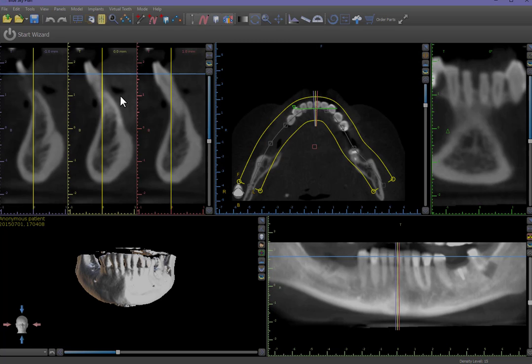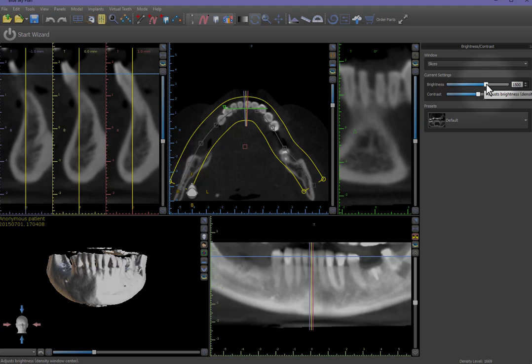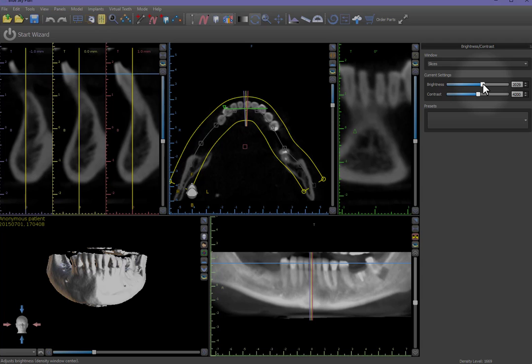Brightness and contrast levels can be adjusted in order to enhance all of the 2D images simultaneously. From the main menu, left-click on Panels and then Brightness and Contrast. Left-drag on the slide bar handles to move the brightness and contrast controls as needed.